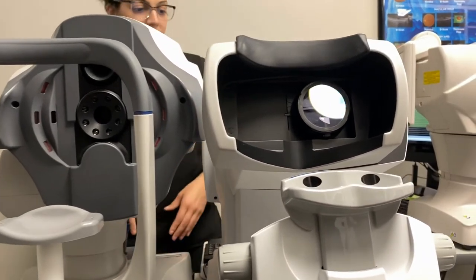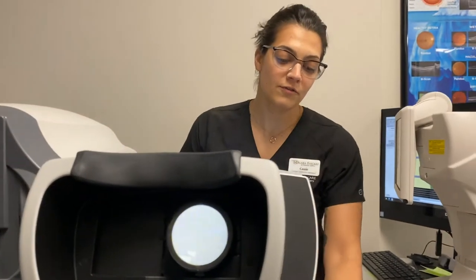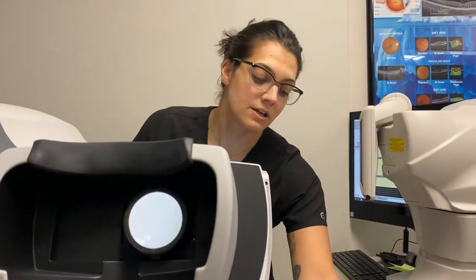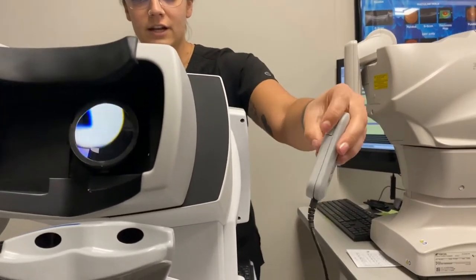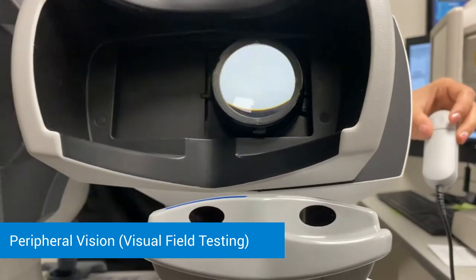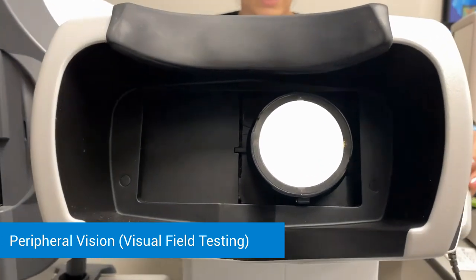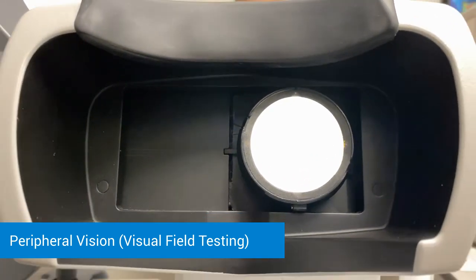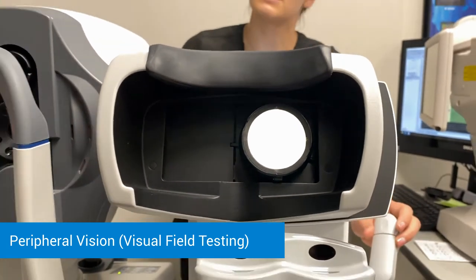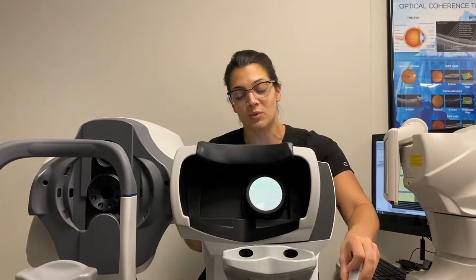That's going to move on to the other eye. Now we're going to check your peripheral vision with the visual fields. I'm going to have you hold the clicker — there's a button right on top. Chin is going to go on the blue side of the chin rest, forehead right against the band. When you look in here you should see a black box in the center to focus on. Periodically you'll see wavy lines flashing in different areas of the screen — whenever you see those, click the button, making sure to blink when you need to.